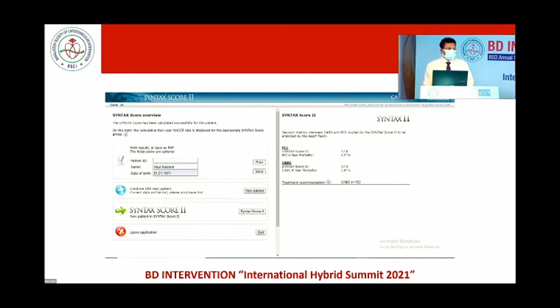Okay, because the patient is very much symptomatic, we deferred the patient, and after 1 month, every 2-3 days he talked with us over telephone, saying sir, severe pain, I can't wait, and I am on a spray. That is why we called him and entered him in the cath lab and did a check angiogram, and these were the findings.